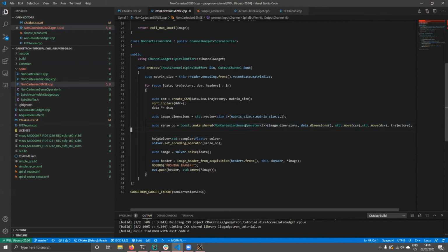The non-Cartesian SENSE operator is like a linear operator. Think of it as a sparse matrix. It's not, but you could think of it that way. Then we need a solver for a linear system. In this case, we are going to use a CG solver, so conjugate gradient solver. We add the non-Cartesian SENSE operator as the encoding, and then we solve and get back our image.